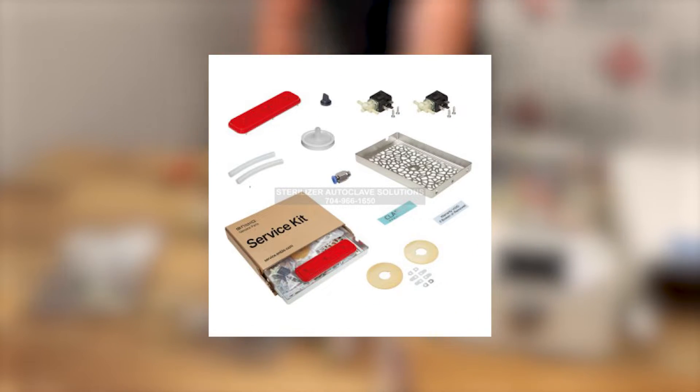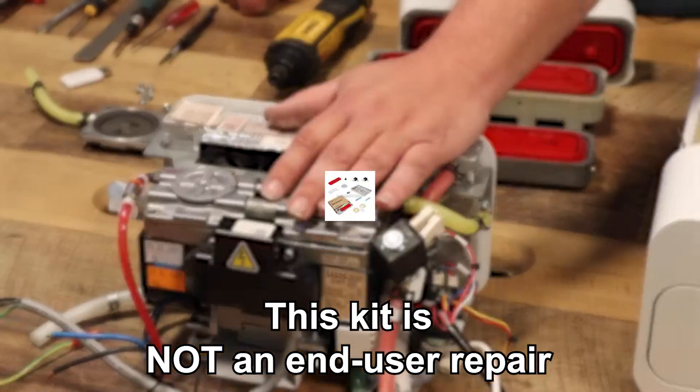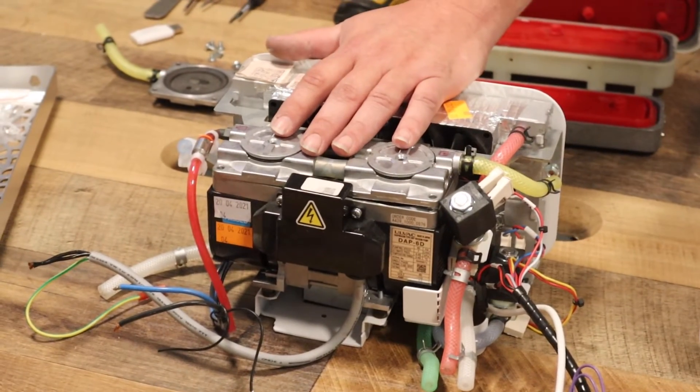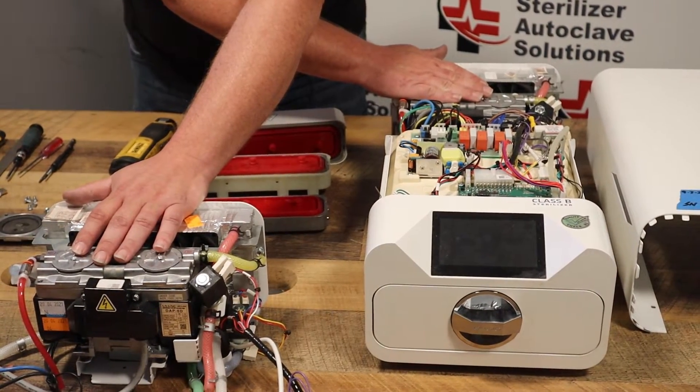Your second kit deals with your vacuum, and once again, this is not end user friendly. As you see, I have a breakdown here. This is when it's completely put together up against the machine.